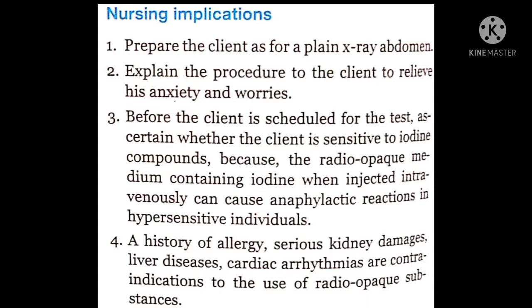Nursing implications: 1. Prepare the client as for a plain X-ray abdomen. 2. Explain the procedure to the client to relieve his anxiety and worries. 3. Before the client is scheduled for the test, ascertain whether the client is sensitive to iodine compounds, because the radio-opaque medium containing iodine, when injected intravenously, can cause anaphylactic reactions in hypersensitive individuals.